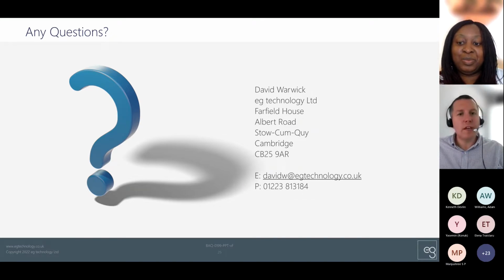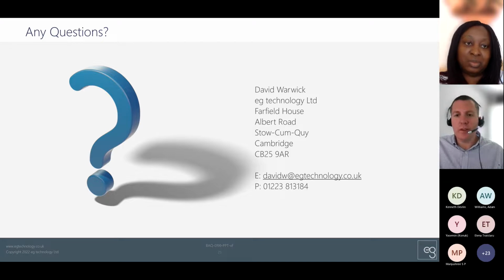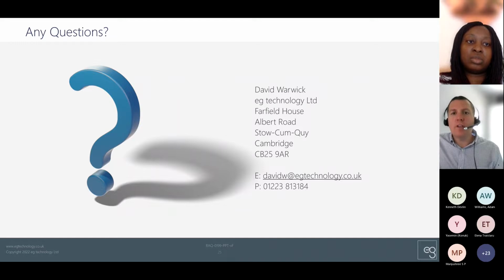As product development engineers, that clinical insight is really, really important. We can help you quantify the risk of failure of a particular part, the risk of electric shock, the tangible things, but you do need that clinical insight as part of your risk management to understand what the actual problem is, what the actual outcome is. Engineers will often think in very black and white terms: this has failed, such and such will happen, patient dies, very bad. A clinician will say, but standard practice, if that occurs, is that we'll do this and then we'll do that, things potentially completely unassociated with your device, but which mitigate the risk to the patient. Lots of these things have an inherent risk to them, and so there are already risk management activities built around standard of care which help mitigate the risk in your device.